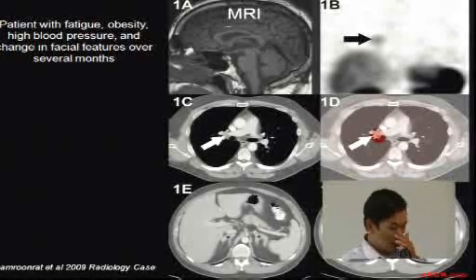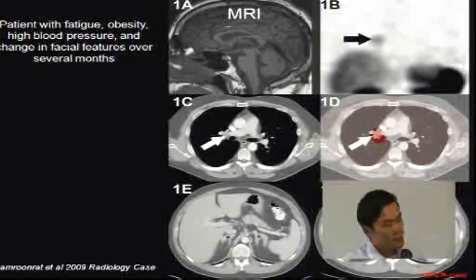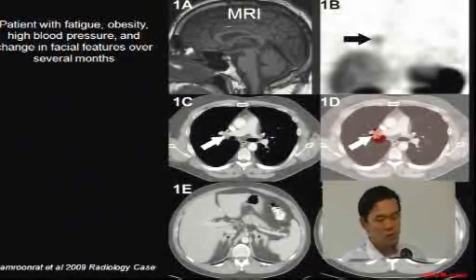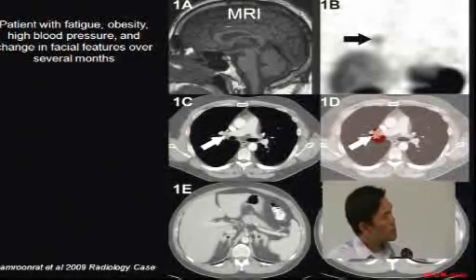An MRI is an outstanding scan, with phenomenal resolution, and it doesn't have any radiation exposure to the patient. In standard clinical care, MRI exams are primarily used for brain imaging. They're outstanding for brain imaging, but they're also good for soft tissue as well, specifically your joints, and for orthopedic applications. In terms of tumor in the rest of your body, I wouldn't say it's the primary choice of imaging, except for some very specialized cases, perhaps in your adrenal gland and in gynecologic organs, etc.